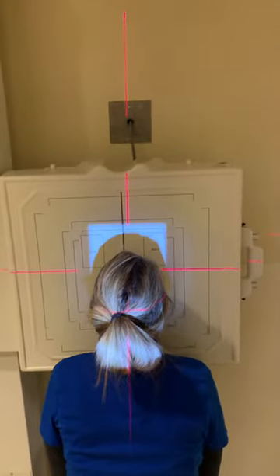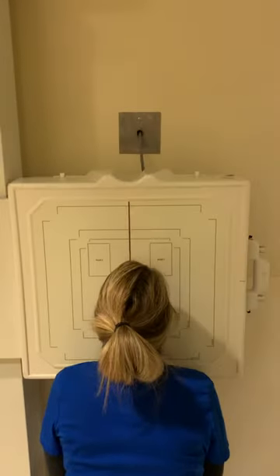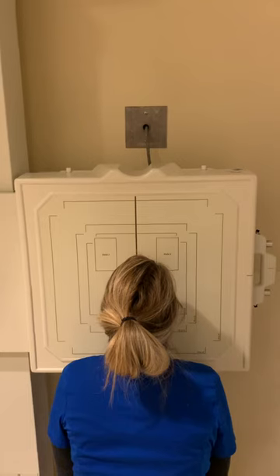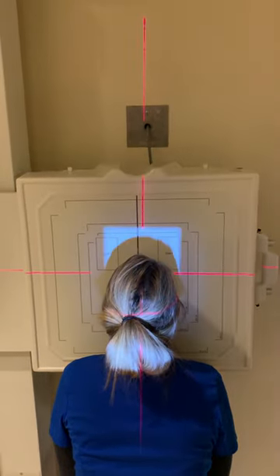We're at 40 inches SID. No shielding is required, and the anatomy of interest is the maxillary sinuses.